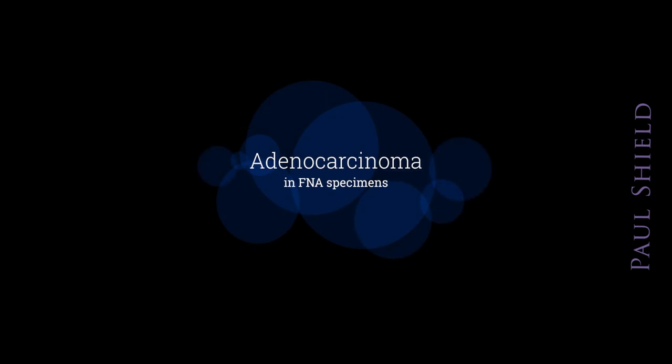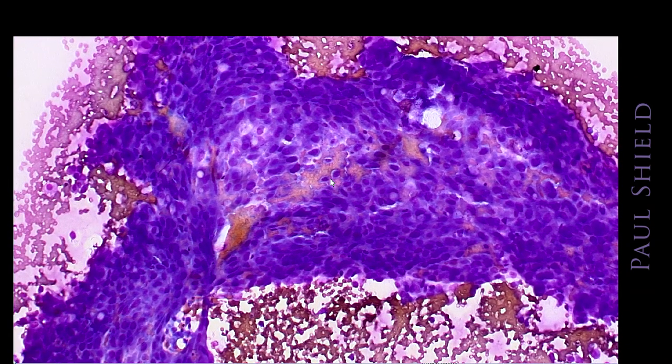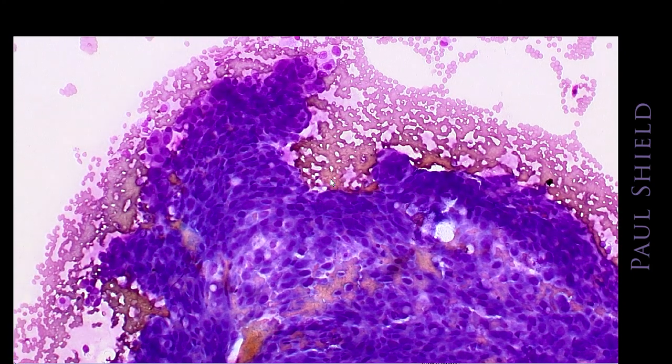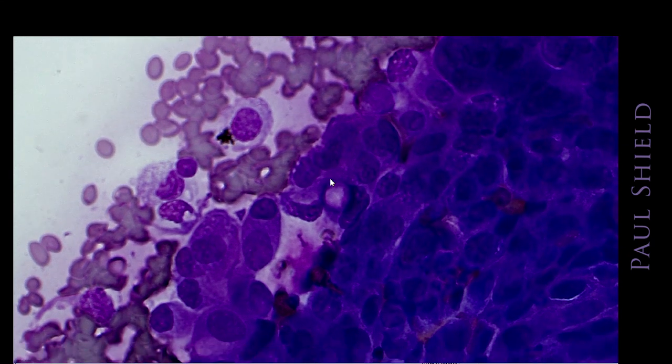In FNA you have better preservation, so you'll have better nuclear detail usually. This is the air-dried Giemsa stain, and can't see a lot of detail, but it's certainly carcinoma. I can see enough to see nuclear atypia at this level, and it's quite cohesive, so we know it's either adeno or squamous probably. That doesn't tell us a lot, but maybe eccentric nuclei in some of those cells off the edge, and maybe vacuolation too.